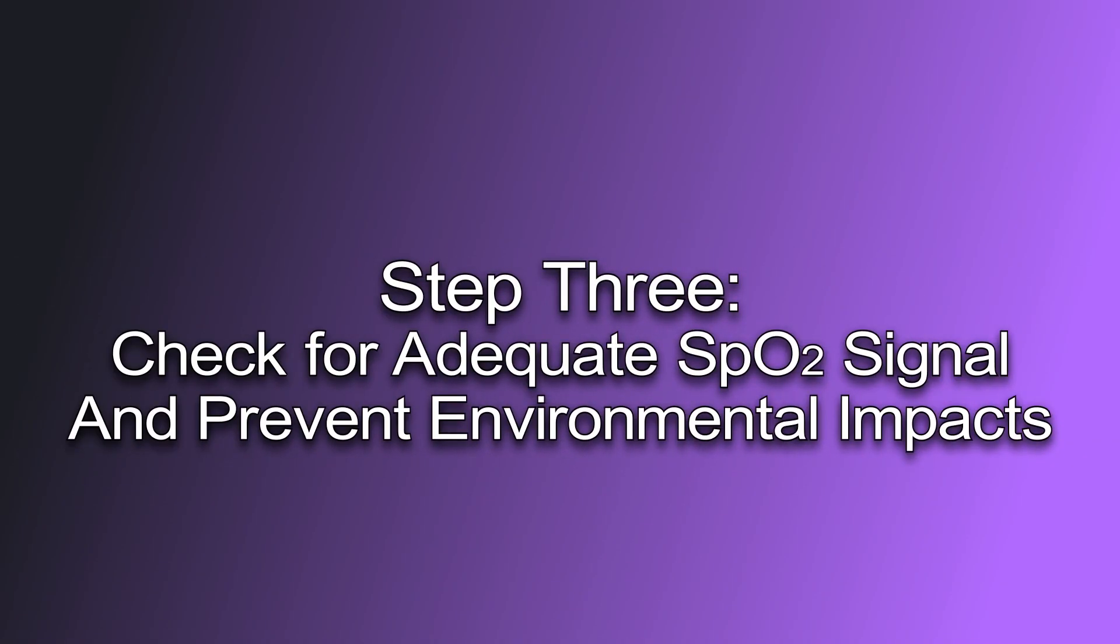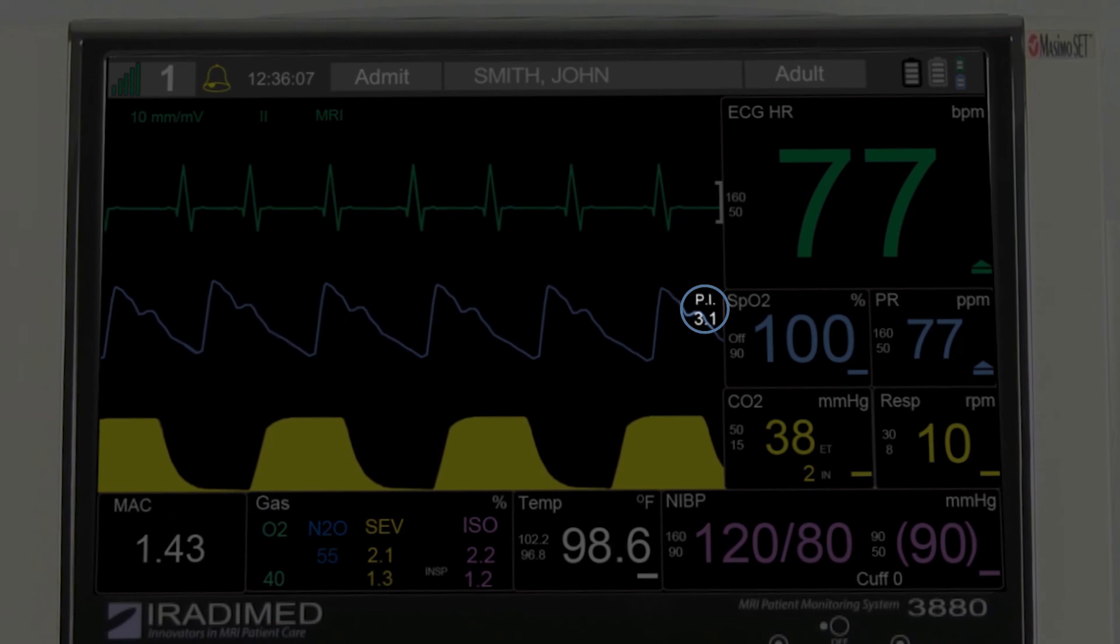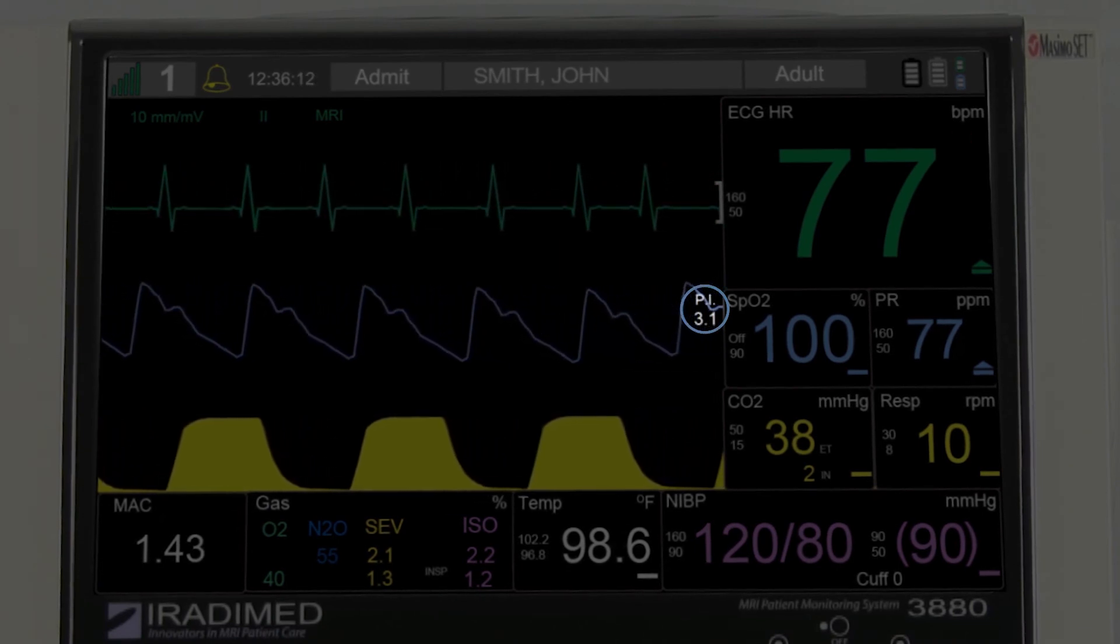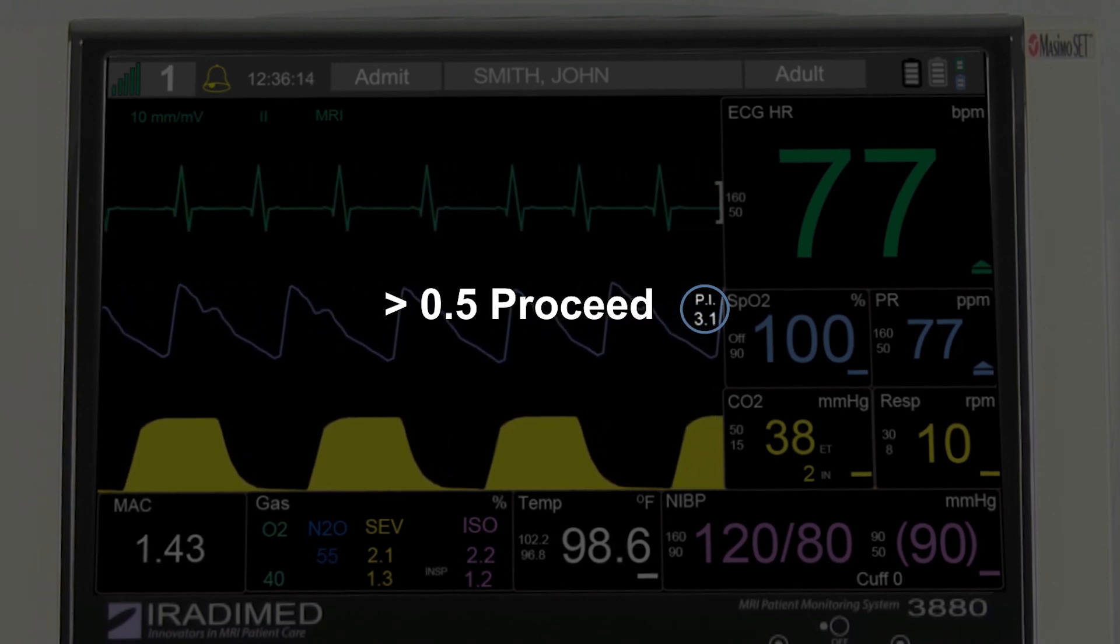Step 3: Check for adequate SpO2 signal and prevent environmental impacts. Check the perfusion indicator to ensure ample signal is being detected by reviewing the PI number on the SpO2 waveform. If the signal is greater than 0.5, then proceed.